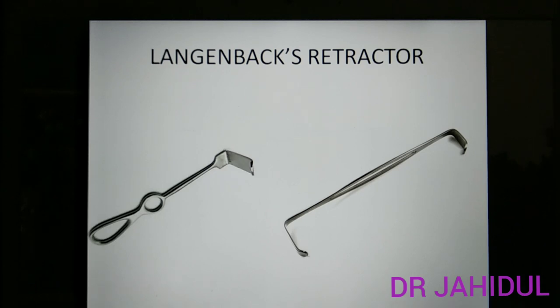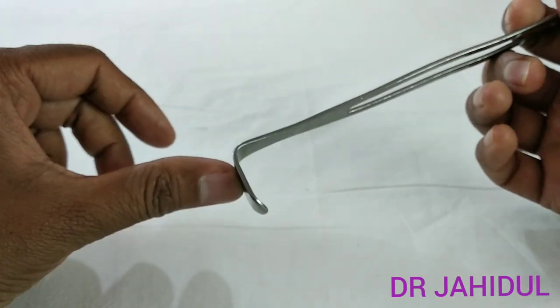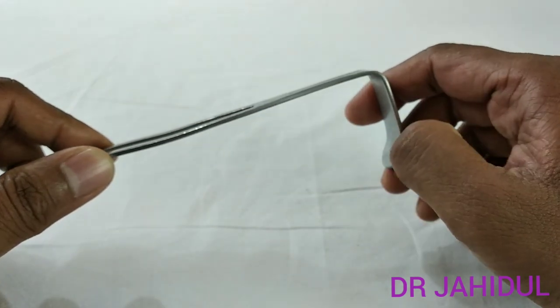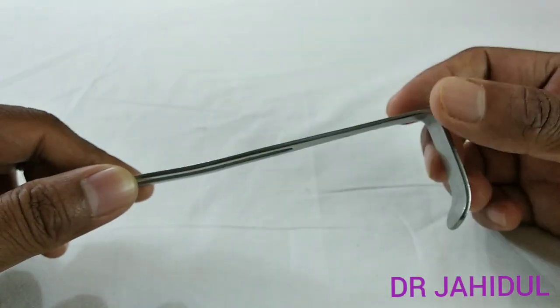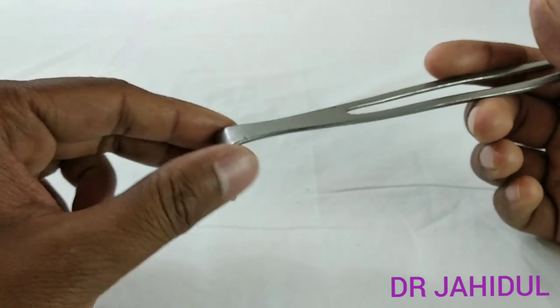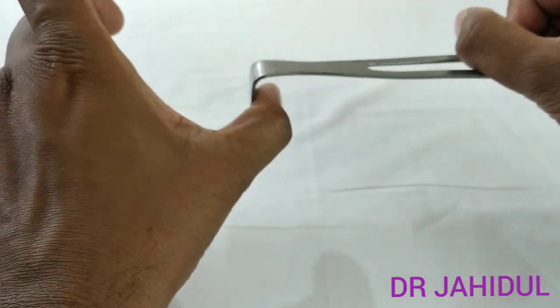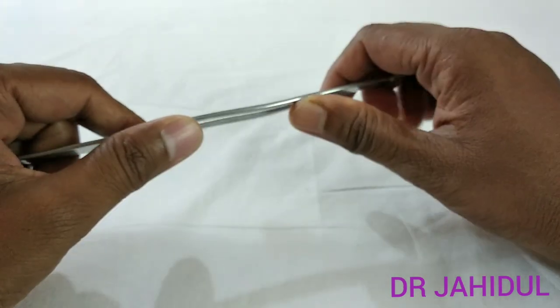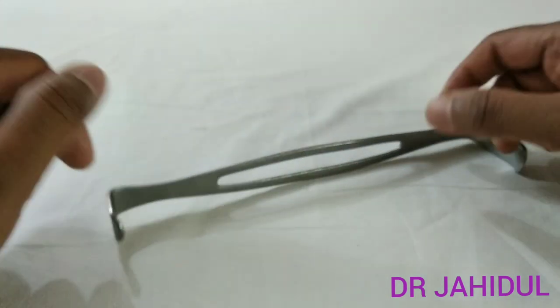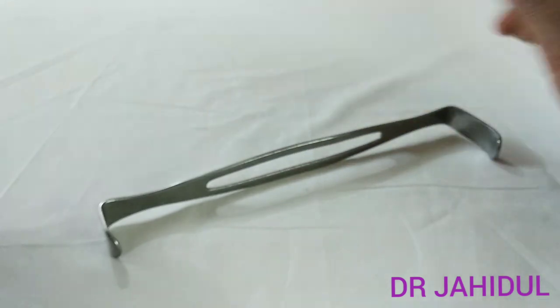This is Langenbeck's retractor, also known as the Right Angle Retractor. It has a long handle with a short flat blade at the tip attached at a 90-degree angle. The tip of the blade is also curved inward for better retraction. It is used for better visualization of the operative field. In appendicectomy, it retracts the layers of the abdominal wall. In inguinal hernia operations, it retracts the different layers for better visualization. It is also used in any superficial surgery to retract skin, fascia, or aponeurosis. As a blunt instrument, it is sterilized by autoclaving.